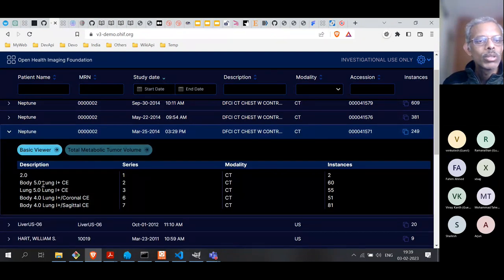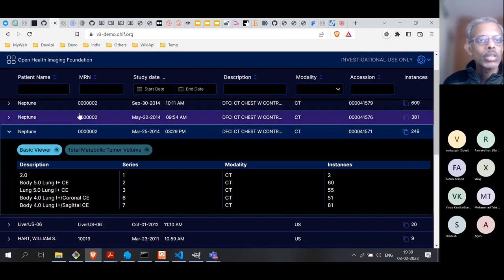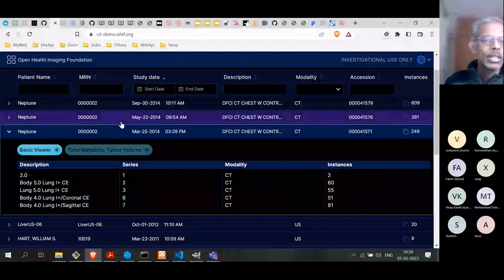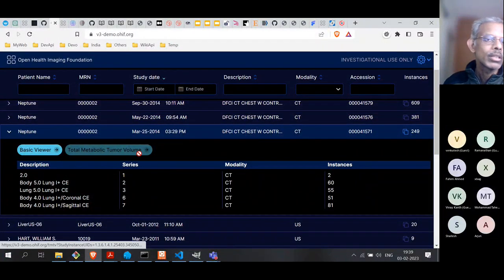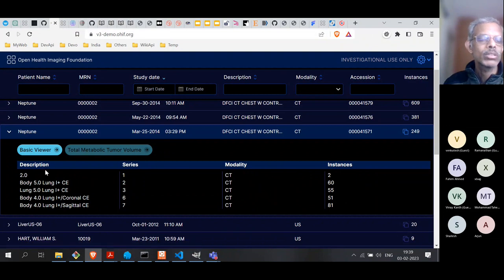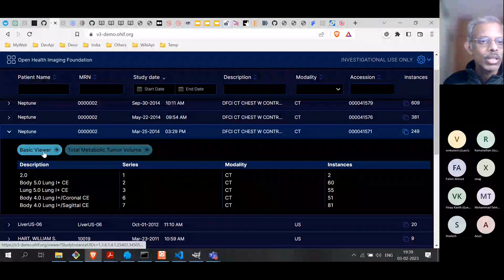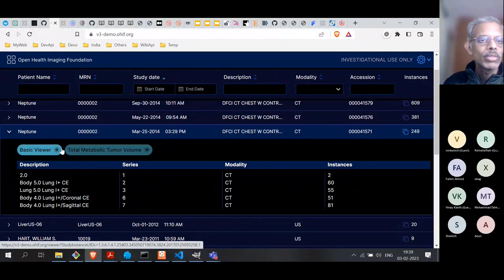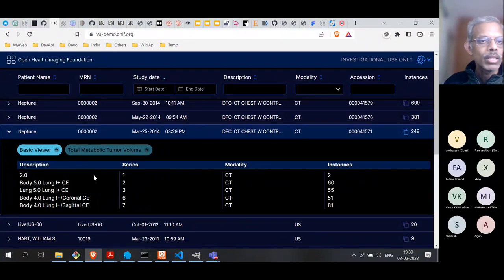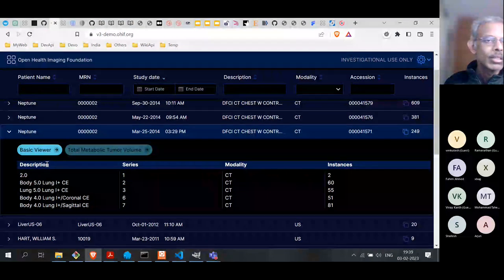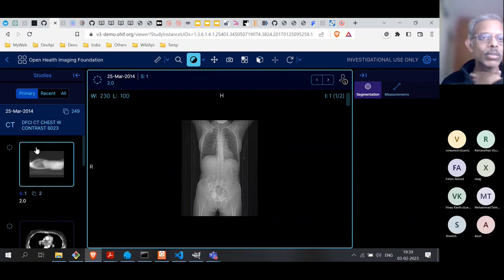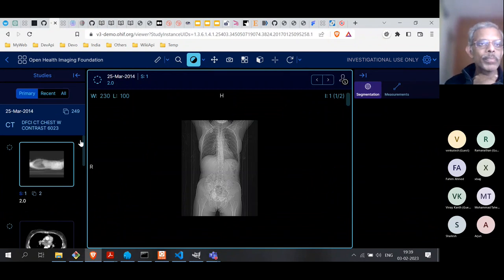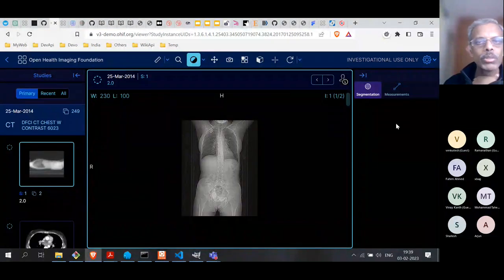Now let's look at one particular study and take a specific patient. All the data we see here is from real patients, but for the purpose of the demo, the scans have been anonymized — so you won't find any real names or addresses. The data is real but anonymized. Let's take a look at one of those studies. This is the kind of view that comes up.